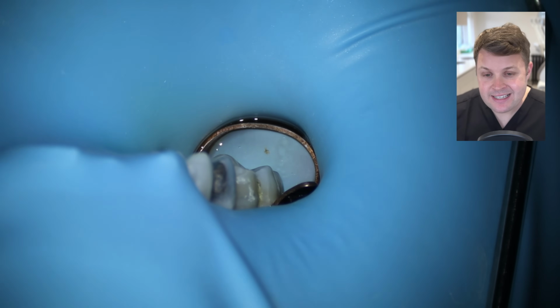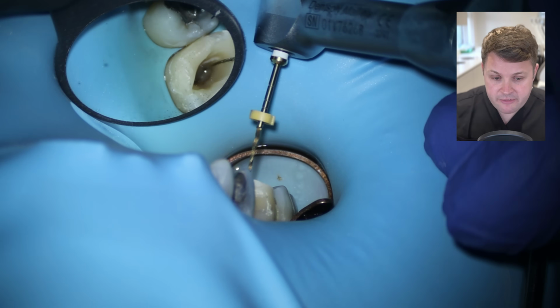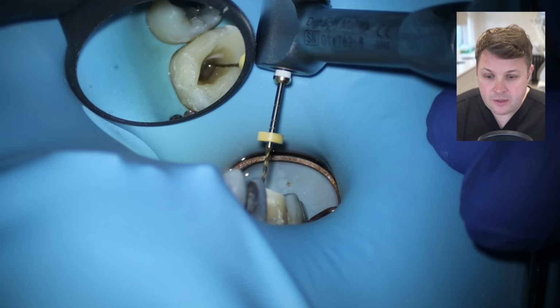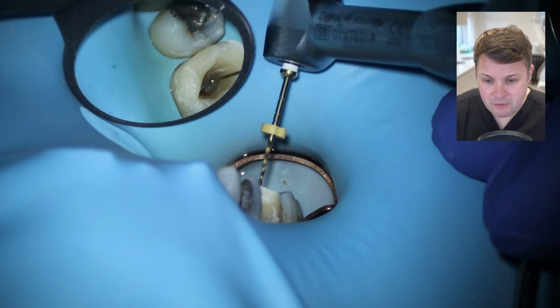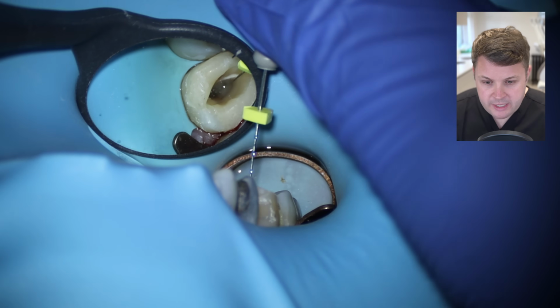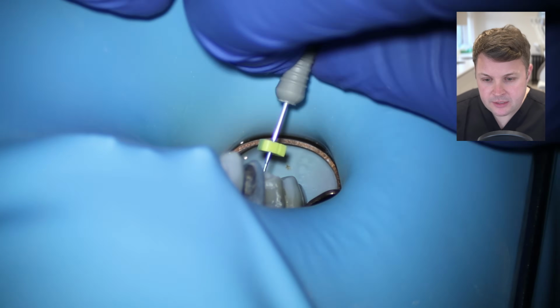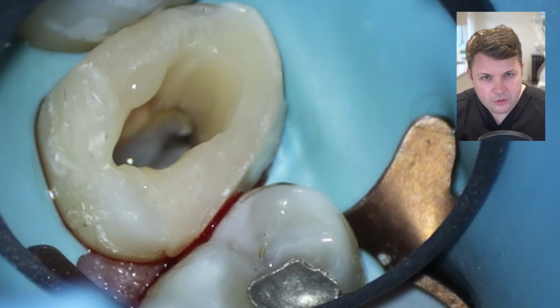I'm going to get a size 15 glide path file, measure it to 17, and then give it a little bit of a shape out. And then don't forget to do our recapitulation. Once we have recapitulated, I just have a little look at this MB, and the MB orifice is looking a little bit unusual.